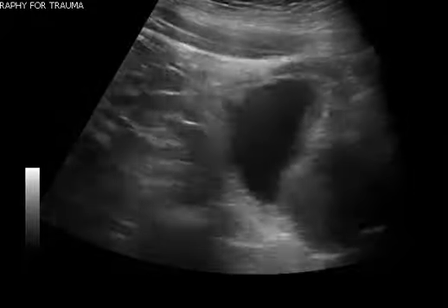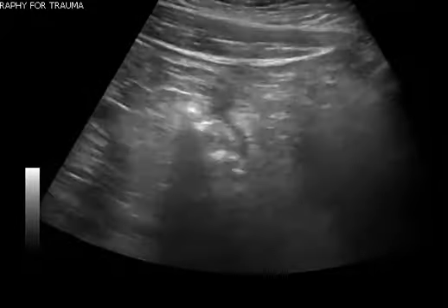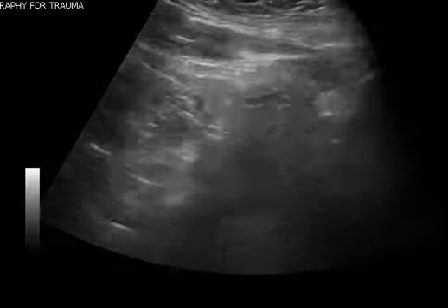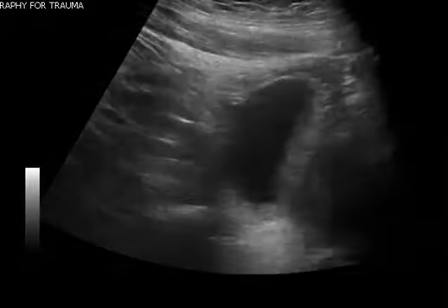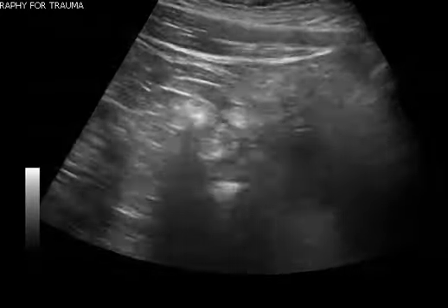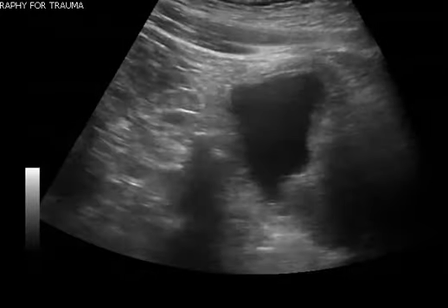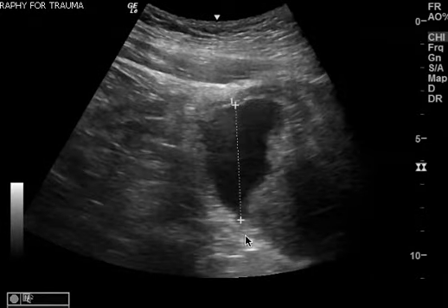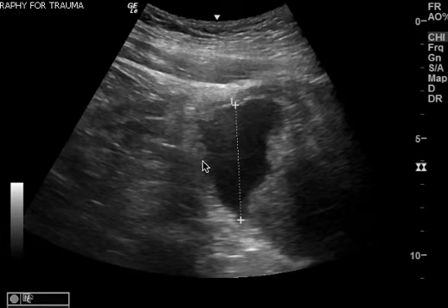The only issue is that when you're doing the bladder in the sagittal orientation with the indicator to the patient's head, this is not the correct way to measure. You want to measure from this point here to here, and that is your third dimension.